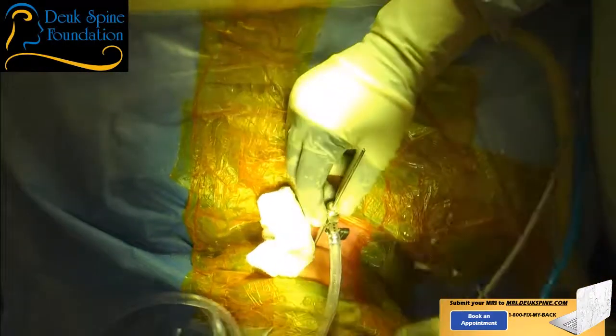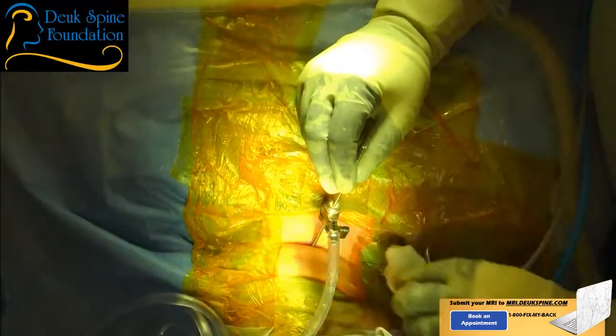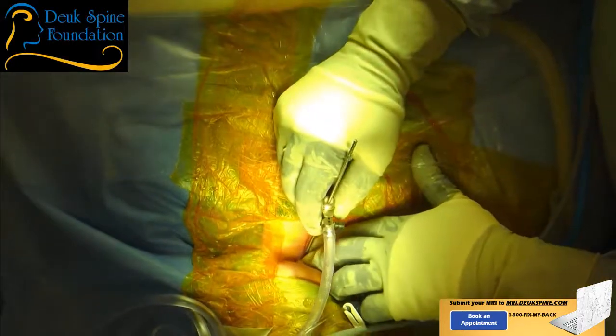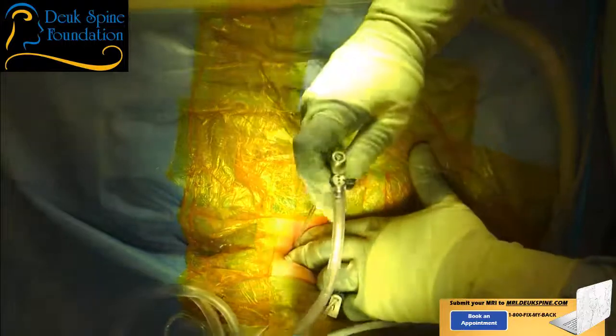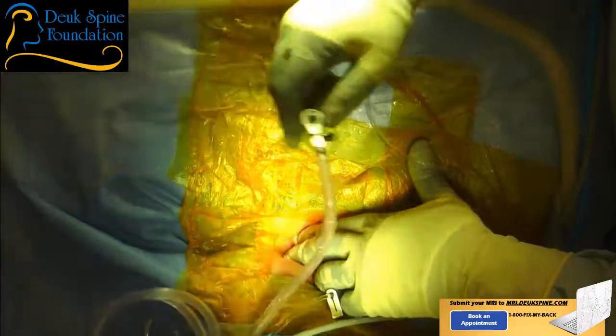Great job, Luis. Great job, everybody. Nice job with the fluoro. Tough case. Everyone has done phenomenal. So we're going to take this tube out. We were successful at treating all three discs. And I'm going to take all this stuff out right now. And we'll apply pressure for about 4 minutes. Here you go.